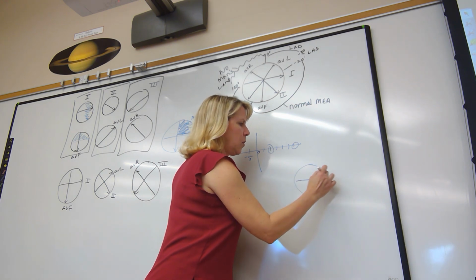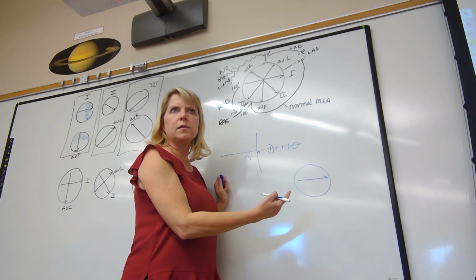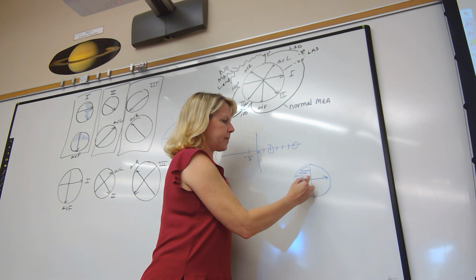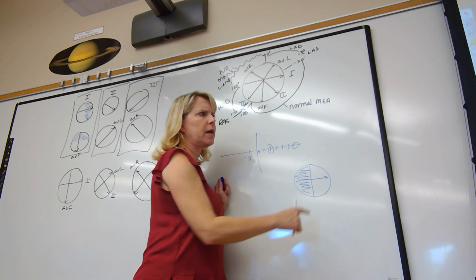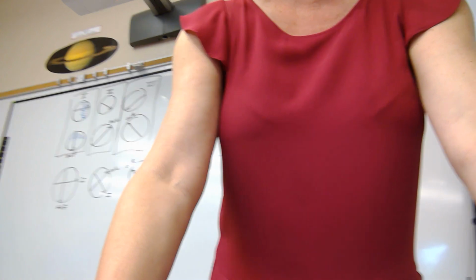So if I have lead 1 and it's overall negative, which side of the circle would you record this? Would you shade it this way? And isn't AVF your perpendicular bisector, as I call it? Okay. So how would you shade that in for AVF in this example?